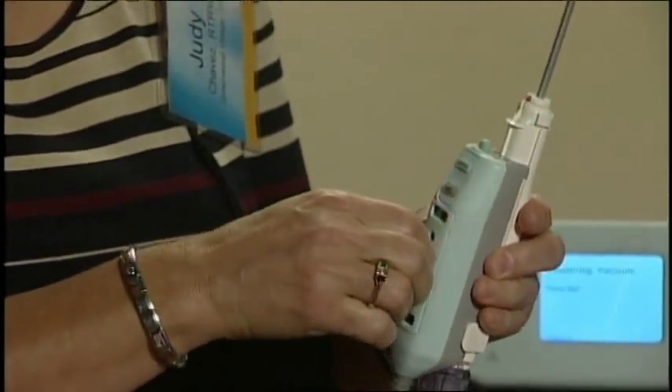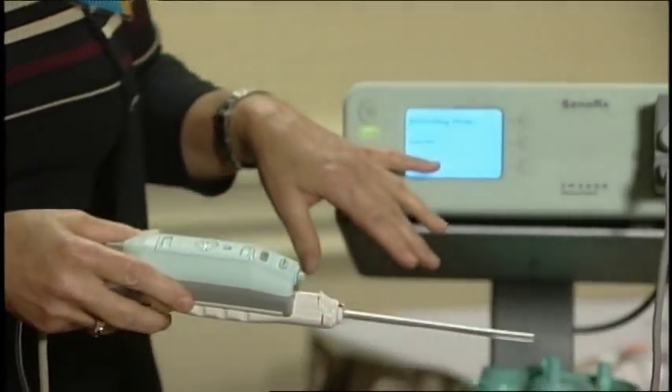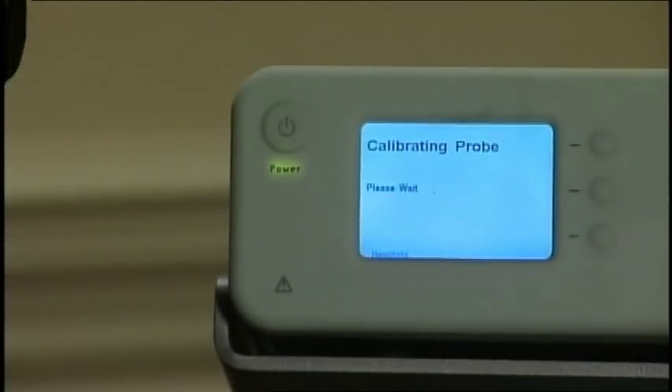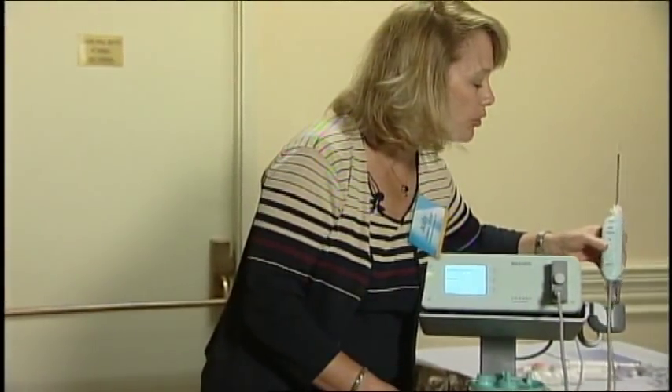We're going to initialize the sample — it will calibrate itself. As long as you're not having any vacuum problems, this should go right through and take a sample with the calibration. We have a little holder over there.